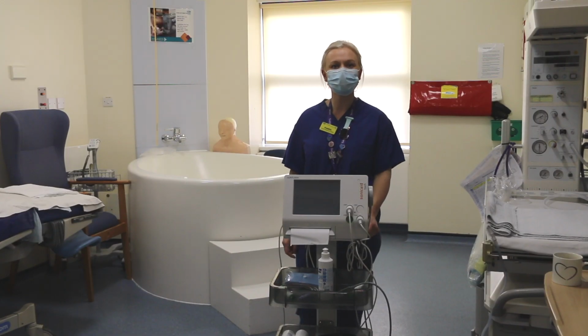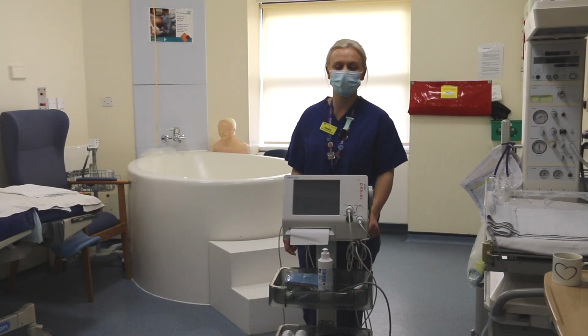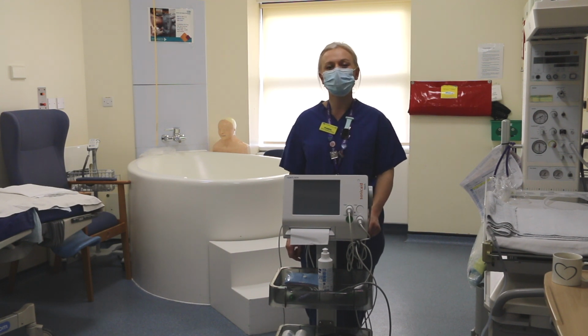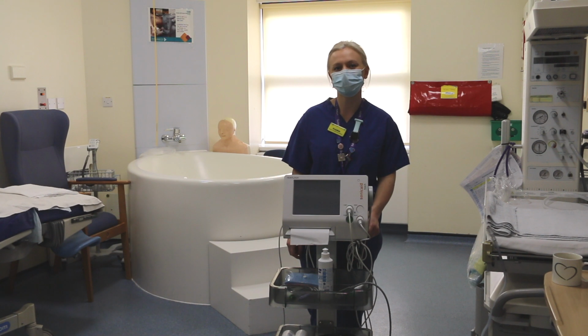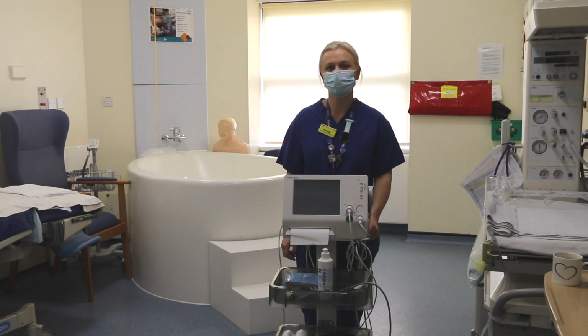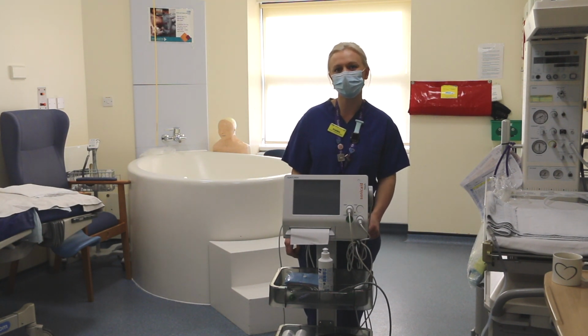Before commencing the CTG, it's important to consider the whole clinical picture and make sure that you have a clear clinical indication for use. You can refer to the antenatal and intrapartum CTG guidelines, and it's also essential that women in established labour have an onset of labour fetal monitoring risk assessment completed, and this is in their notes.